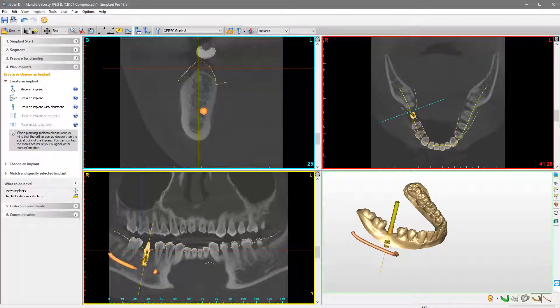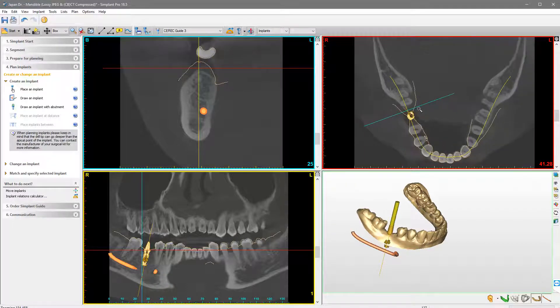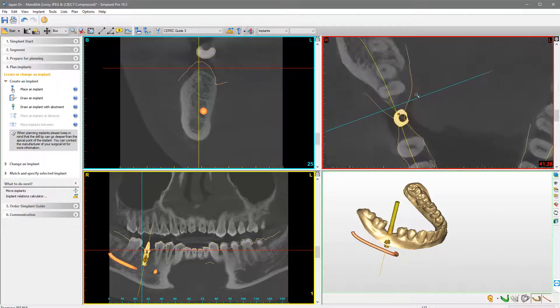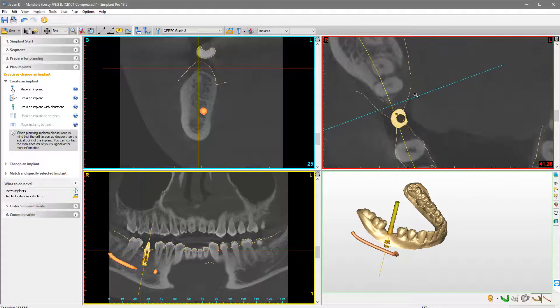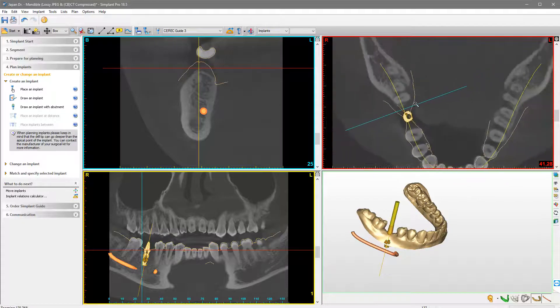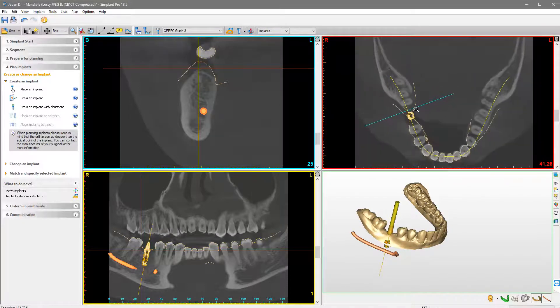Finally, you can better focus on the areas of interest by zooming and centering any of the 2D or 3D views. To zoom in or out, please hold your CTRL key and the right mouse button of your mouse while moving the mouse up and down in one of the views.